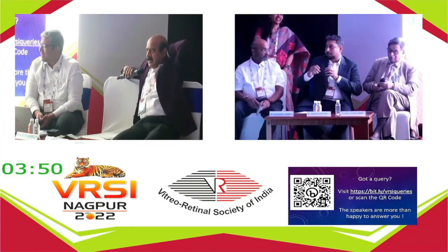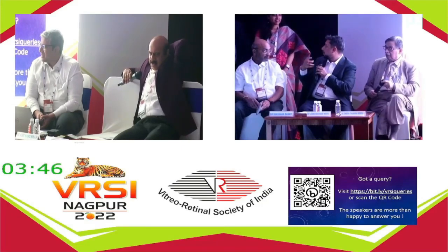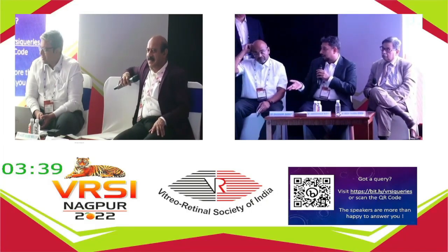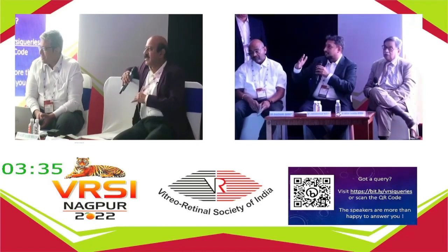Yeah. And let me just point out, when you're talking about true color, I just got it: true color is a color that we mentioned in a four channel thing. And multicolor is when you have a three channel, when you talk about the Heidelberg. So yeah, you're going on and on supporting each other, well adjusted during the coffee break.